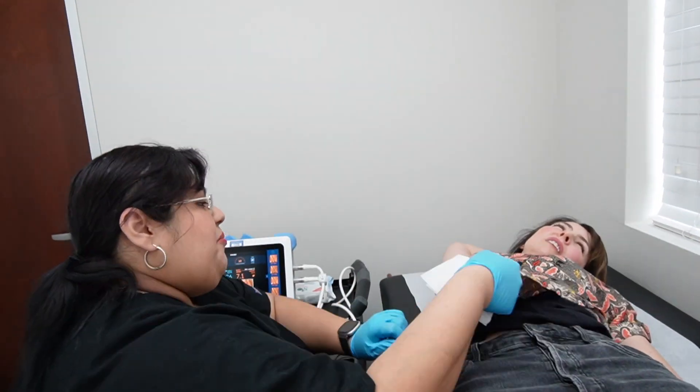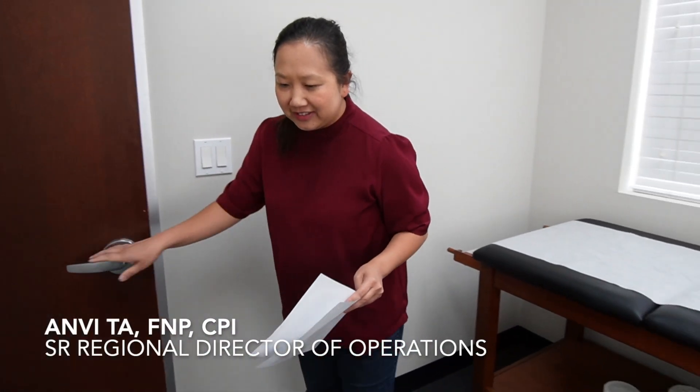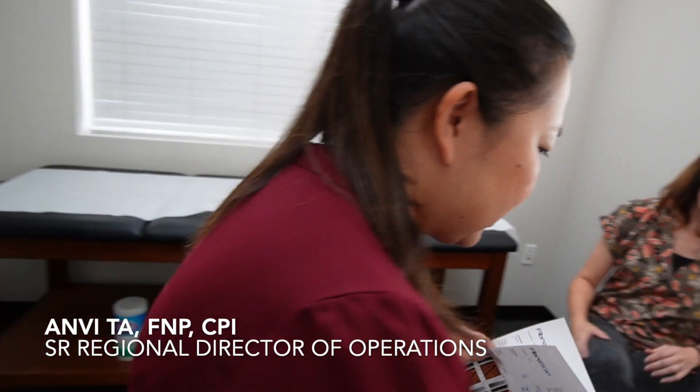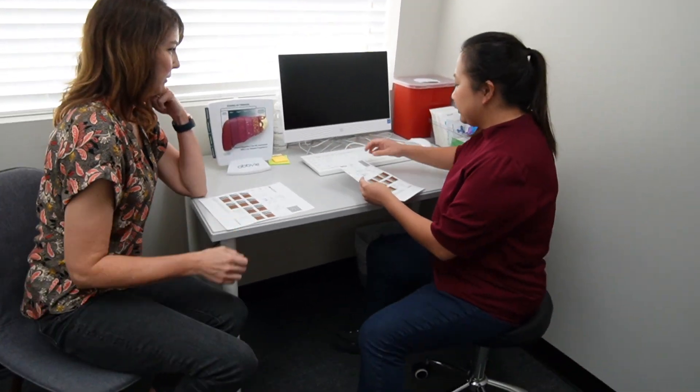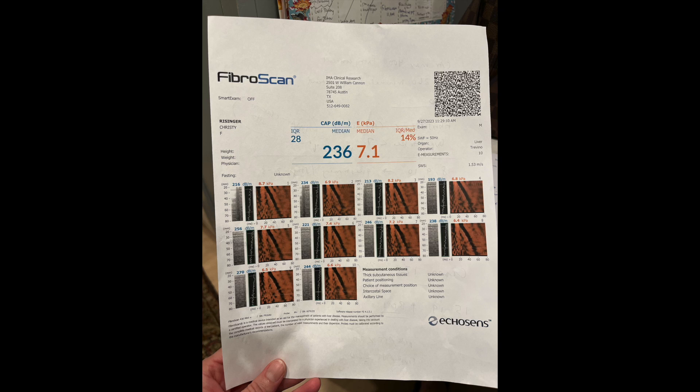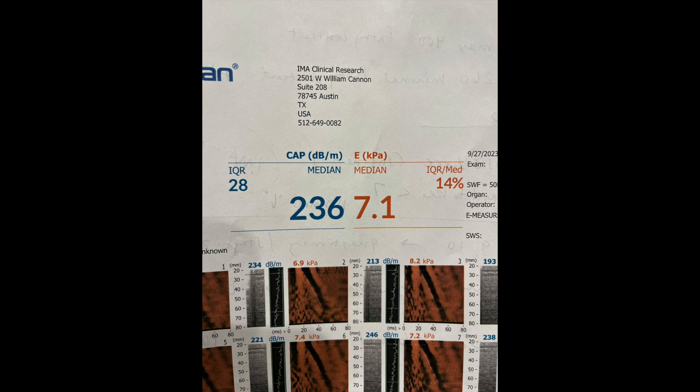Once my FibroScan was done, I spoke with Andy Ta, who was a family nurse practitioner and the senior regional director of operations at IMA Clinical Research. She and I went over my results and it was really, really fascinating. This blue number that you see on my sheet is the CAP score and that tells me the fatty content of my liver.